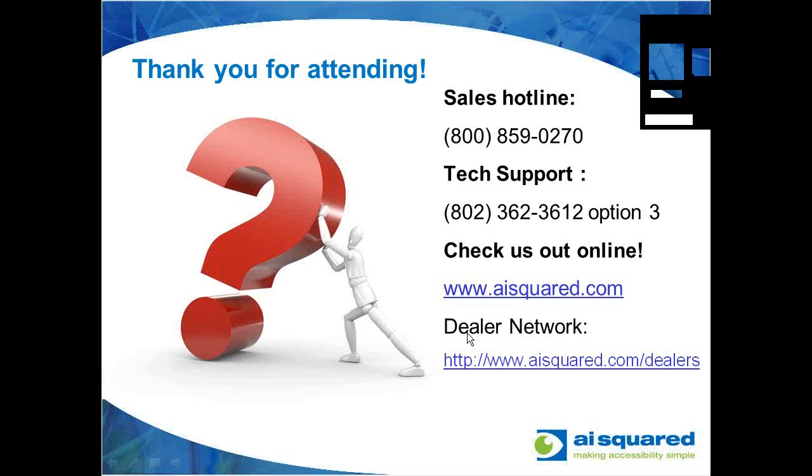One thing to stress too, a lot of people may think that this is a complete replacement for a traditional desktop CCTV. Now, while this does offer most of those features and really good camera quality and magnification of text, it's never going to approach the magnification and motion clarity of a dedicated CCTV. We're also talking somewhere 10 to 15 to 20 times the cost for those devices. So this is really a great, affordable, and portable CCTV alternative.